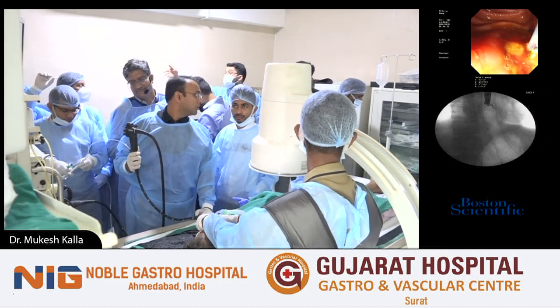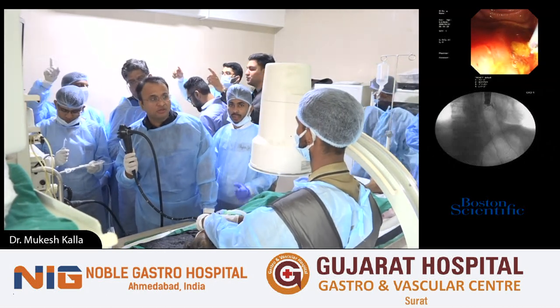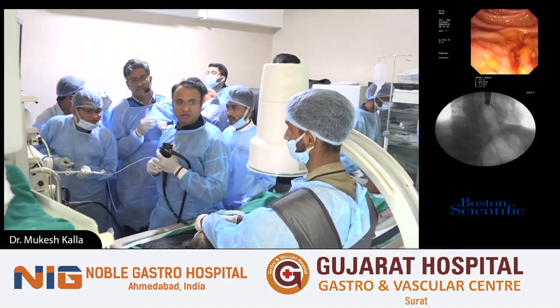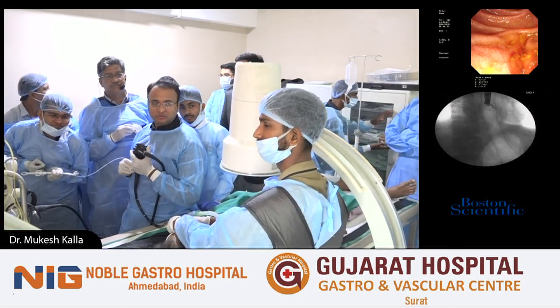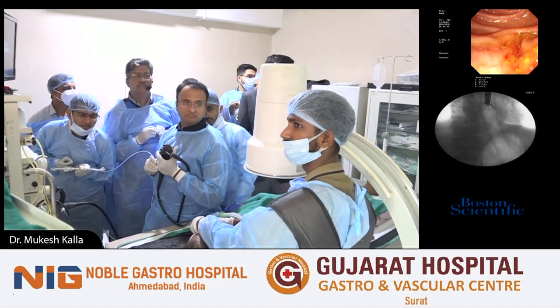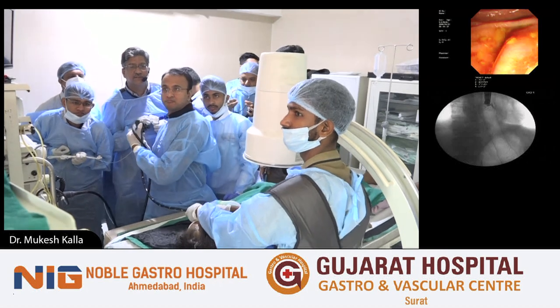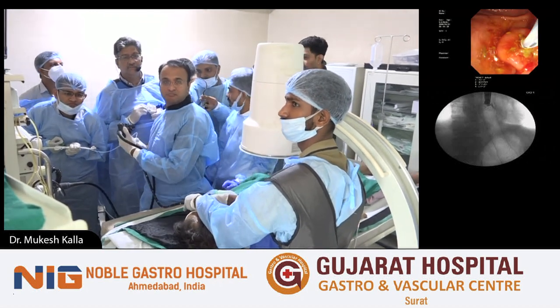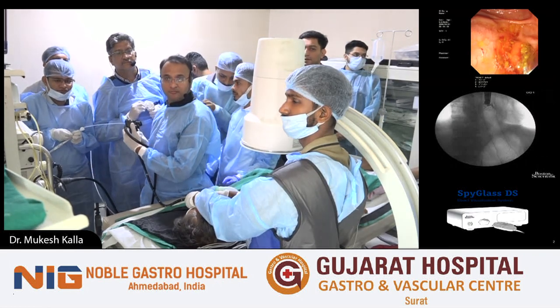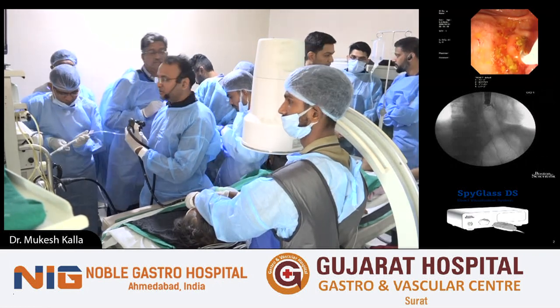Based on that, the fact is that we must accept the situation. These are difficult stones. Many centers do not have very advanced equipment, and equipment needs superior skill. You just cannot bring an equipment and start doing it in all difficult cases. A large population has a limited financial pool and resources. So the objective here should be stone clearance and recurring cost. So give your best shot.